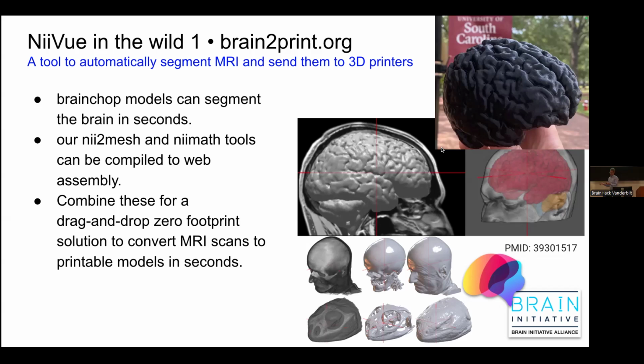Do they need a specific NVIDIA graphics card and CUDA libraries and all these other aspects? But in truth, AI models are incredibly compute intensive to develop, but the actual inference can be done very efficiently on any graphics card using web technologies. And so there's modern tools like ONNX, TensorFlow.js, and tinygrad that are able to use the end user's computer.